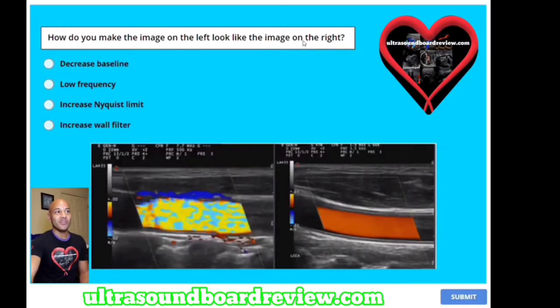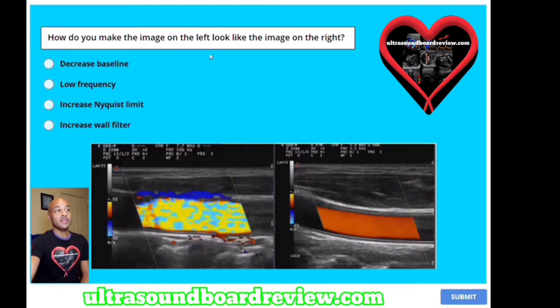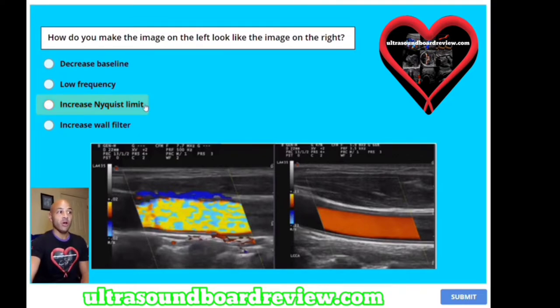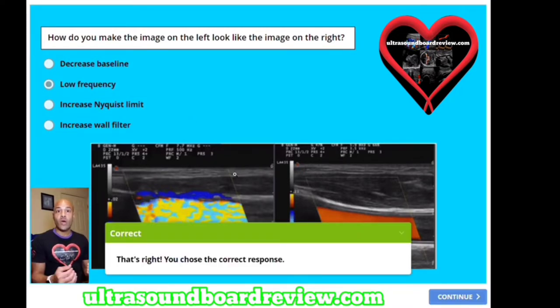How do you make the image on the left look like the image on the right? A) decreased baseline, B) low frequency, C) increased Nyquist limit, or D) increased wall filter? When you adjust your baseline, that will adjust your no-Doppler-shift zone up or down. Increased Nyquist limit — no, because it's already increased here. Increased wall filter — no. Low frequency — yes. The best option for this question is to lower your frequency.